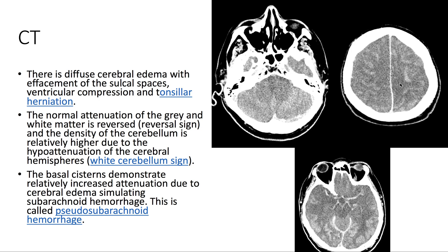Additionally, we see that the cerebellum has higher attenuation in comparison to the cerebral hemispheres. This is the white cerebellum sign. The basal cisterns demonstrate relative increased attenuation due to cerebral edema, simulating subarachnoid hemorrhage. This is called pseudo-subarachnoid hemorrhage.